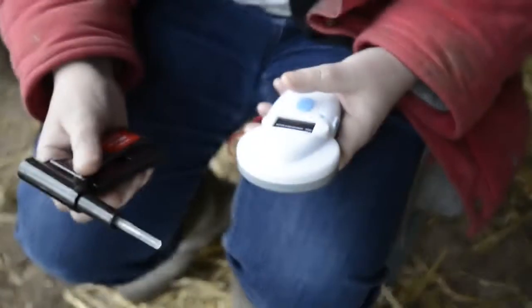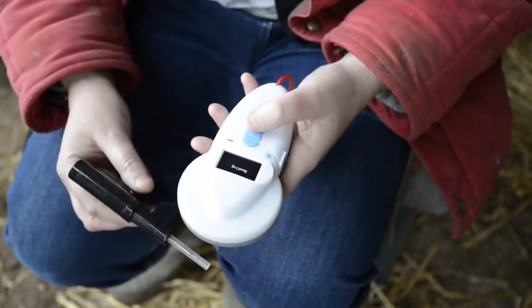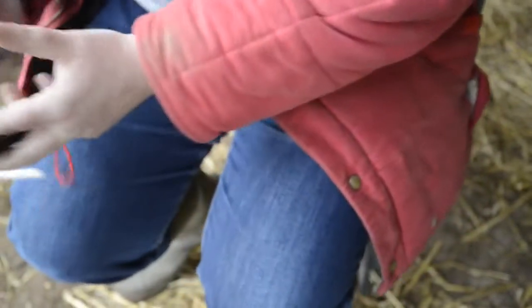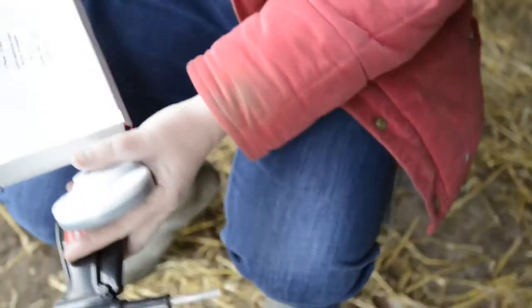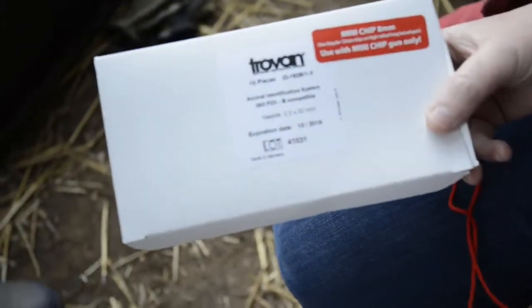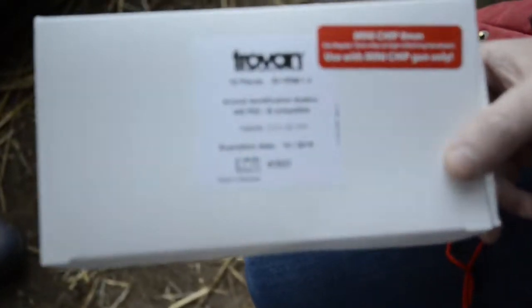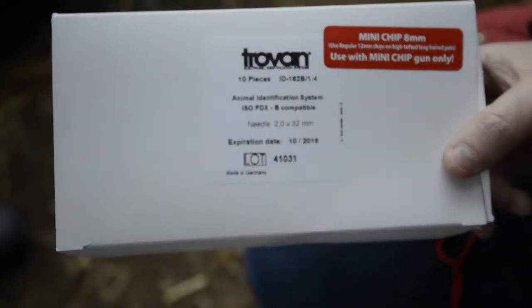We're just checking that the chip is actually working in the needle before we go to implant it. You can see it reading quite well there. We've proved that the microchip is working. We're using the Trovan mini microchips — these are only 8mm long and 1.4mm in diameter.